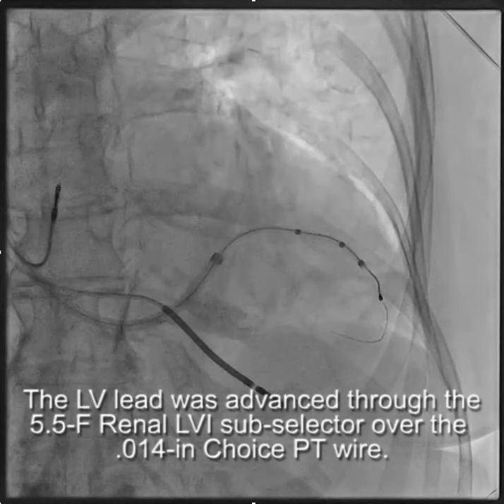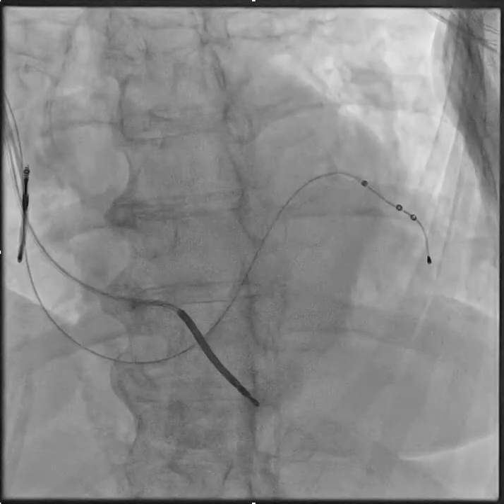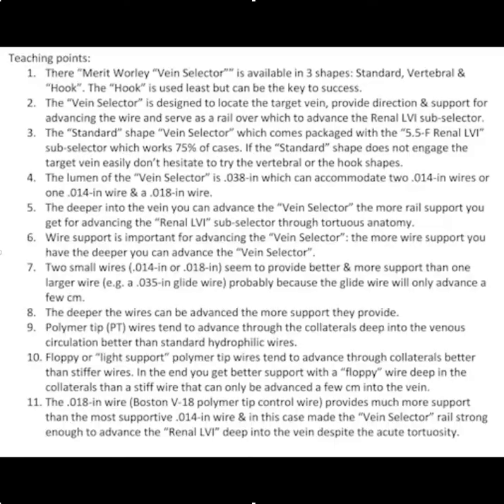So from there, we're able to put the lead in, slice away the sheath, remove the vein selector, slice away the 5.5 subselector, and then peel away the sheath, and we have a successful implant.